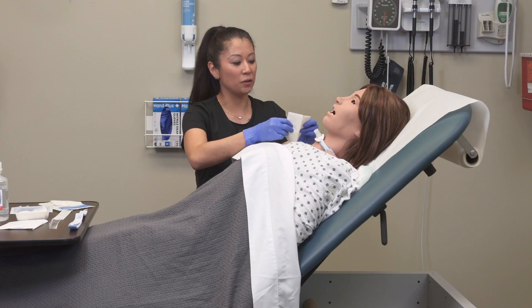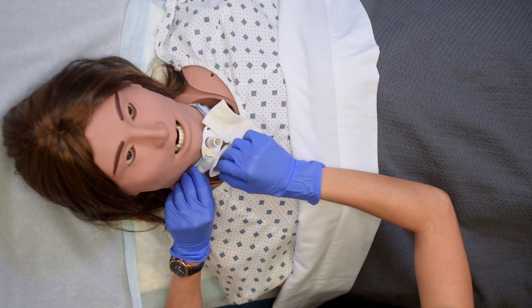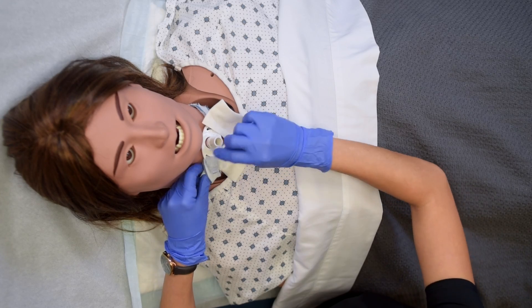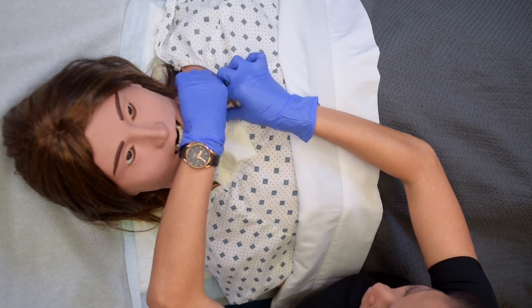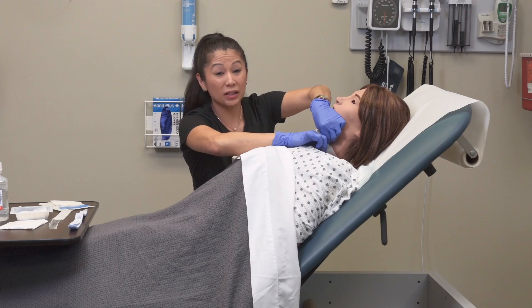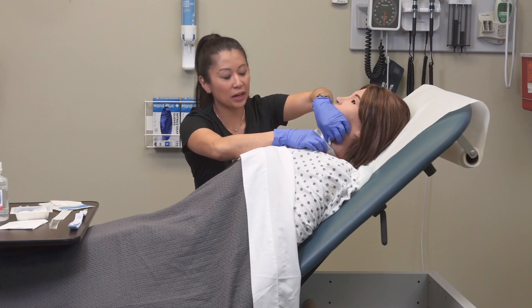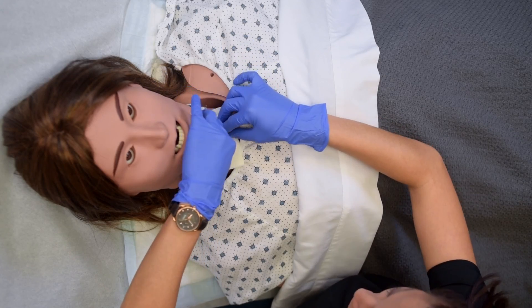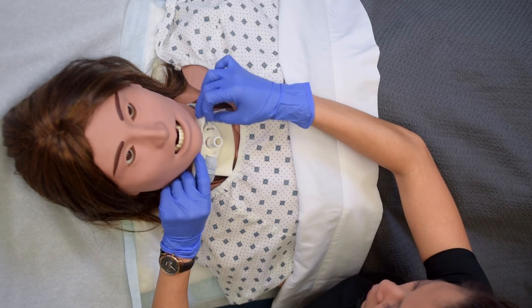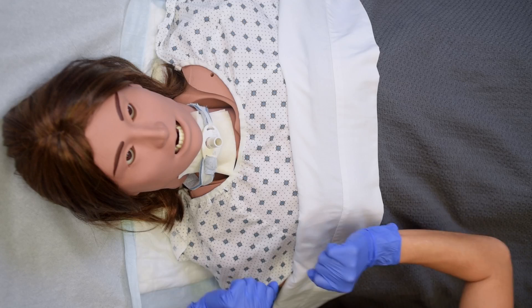I'm going to go ahead and apply this around and simply slide it underneath the flanges. It's personal preference — you can loosen up the holder if need be, but I usually keep it on just to make sure everything's stable, especially when working alone. I'm just going to fit this around neatly and smooth it down around the tracheostomy site.